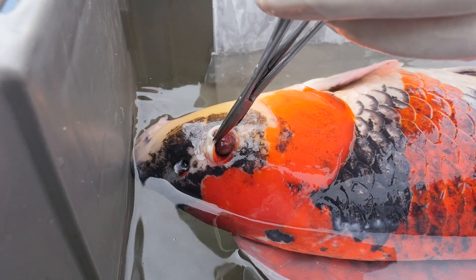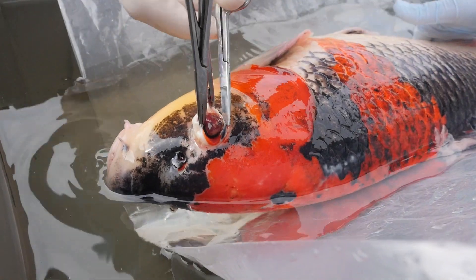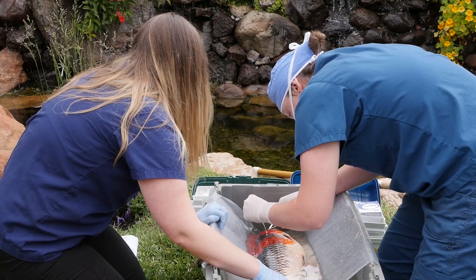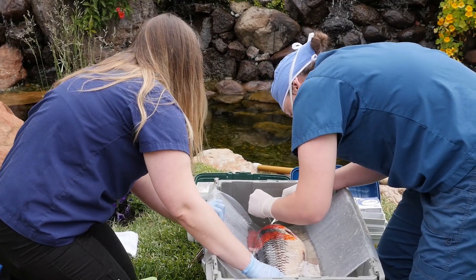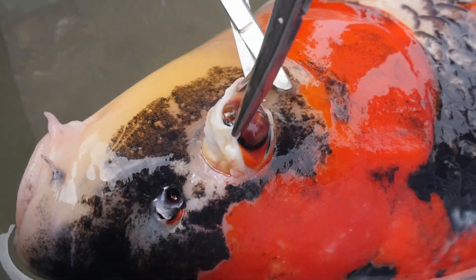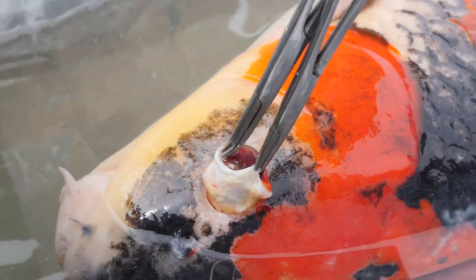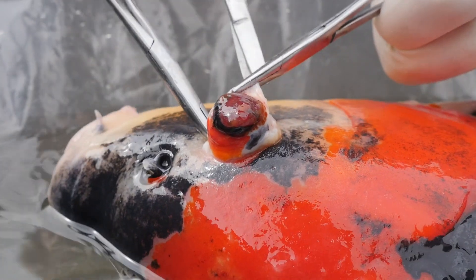He's doing fine, pulling back a little bit again. Let's try to keep his nose from being up against the bucket. I've got that yellow tissue around the back — it's just fat. Getting there. That's a lot of fat. Sorry fish, not your fault. That's severed that little piece of skin that runs around the eye.